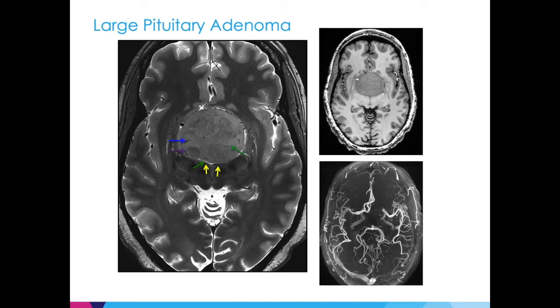And the tumor itself has areas of heterogeneity within it, firm and soft areas, very important for the surgeons in trying to plan their surgery. And these are depicted quite nicely with the resolution at 7 Tesla. The time-of-flight angiography sequence, which operates much more effectively with these longer T1s at 7 Tesla, actually really helps with the depiction of the branches of the arteries feeding the brain.